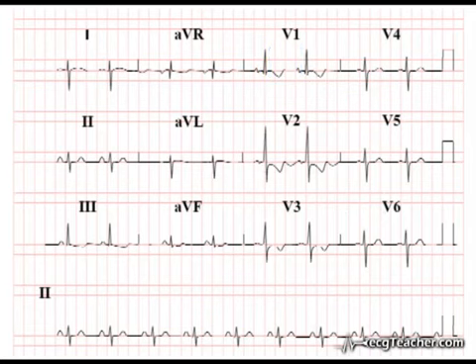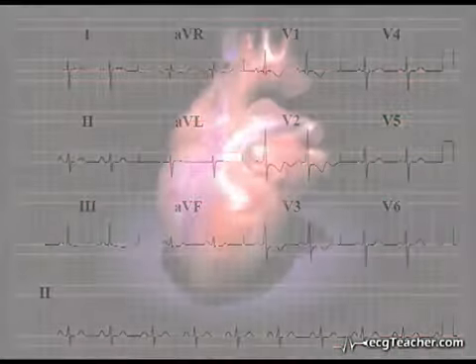However, as for LVH, the sensitivity of the ECG in the diagnosis of RVH is poor. In fact, it is only possible to diagnose about 1/5 of RVH cases from ECG changes alone.